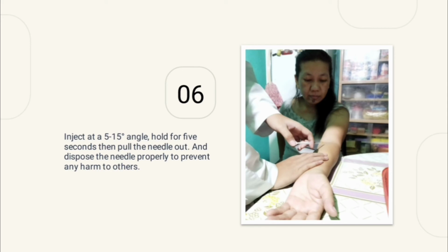Now, there is a technique in administering tuberculin syringe, and it is called Mantoux technique. It is typically performed on the inner forearm and creates a bubble of liquid that is eventually absorbed by the body.